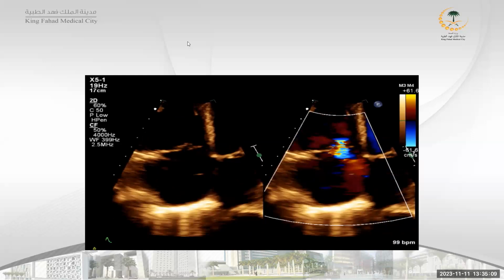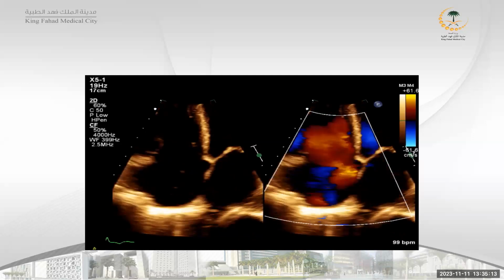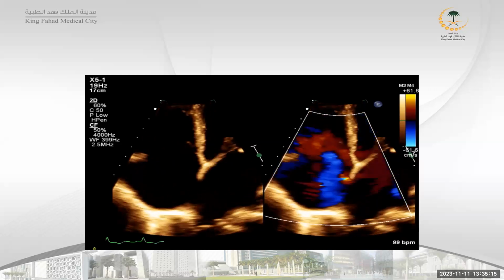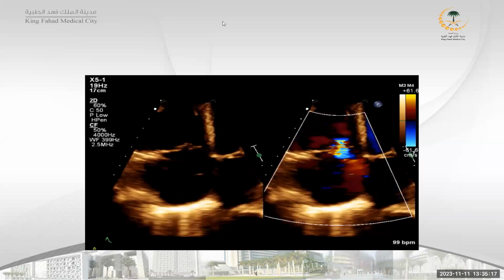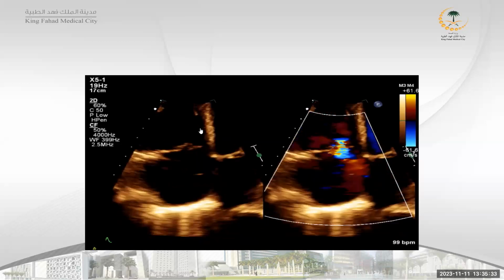Stenosis? I think there is no stenosis here. The tricuspid valve is opening well, and you don't have flow acceleration across the tricuspid valve. So there is no CT. Somebody wrote CT, and this is an abbreviation of crista terminalis or CT scan. Okay, that's right. This is the Eustachian valve. You can see the Eustachian valve here.